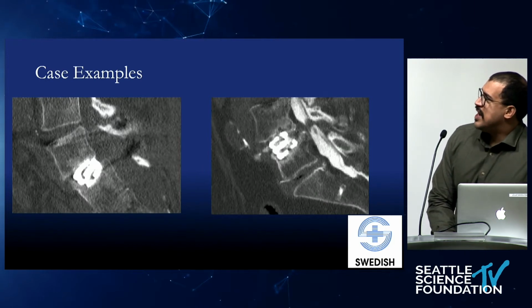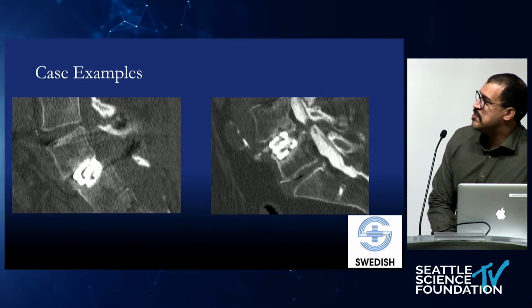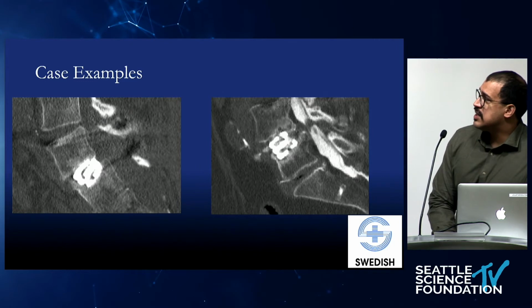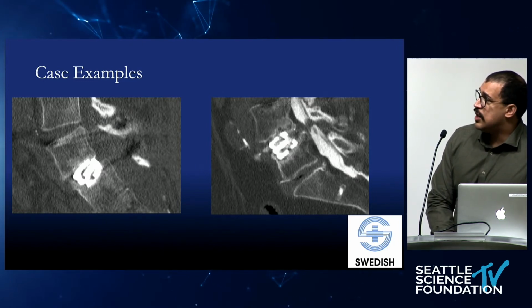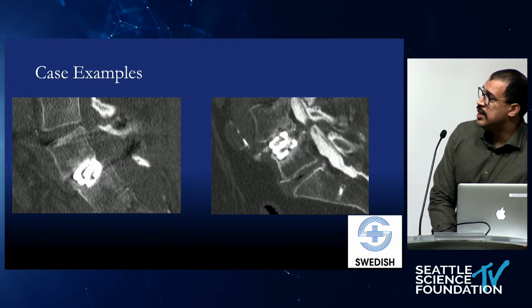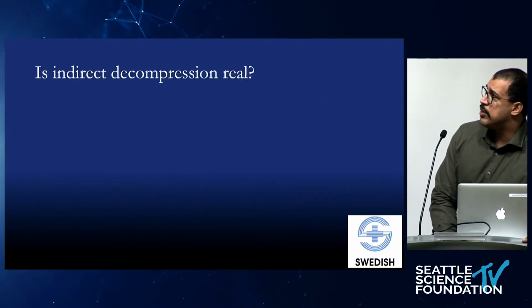So these are just a couple case examples. Both of these patients came to my clinic on the same day, having had MIS TLIF. Looking back at the films, they were both put in, and subsided like this. So, we have really great new technology that's coming out that can allow you to get really good correction through a very small window. But if you're not using the appropriate techniques, you can put them in without getting the results you're hoping for.